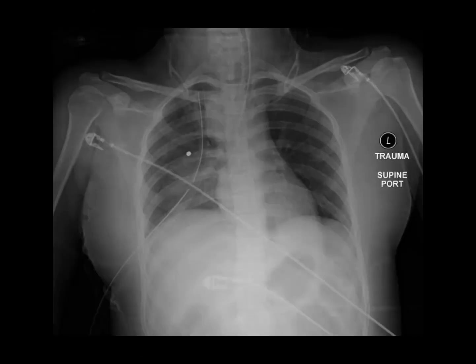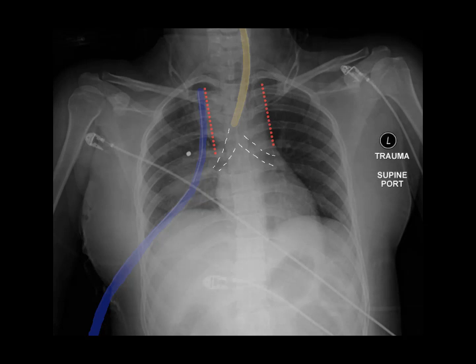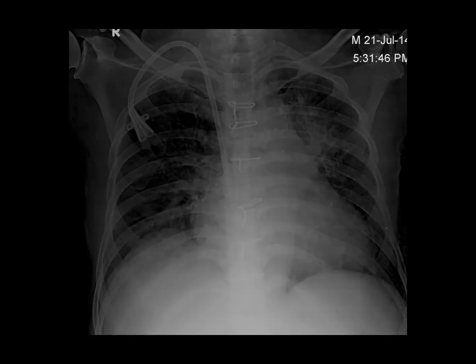Here's a patient post-chest tube placement for right chest injury. We see the endotracheal tube and the carina, and we see the right chest tube itself with its proximal side hole well within the thoracic cavity and the tip against what appears to be a widened mediastinum.